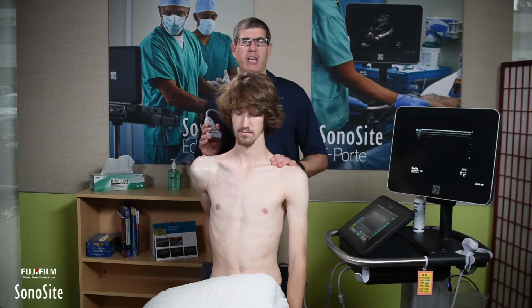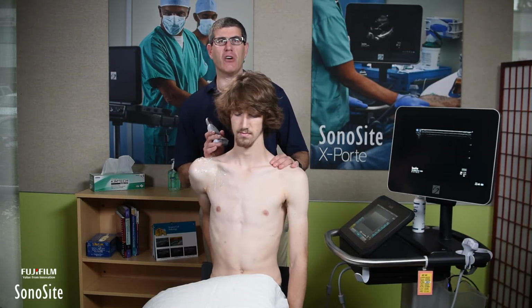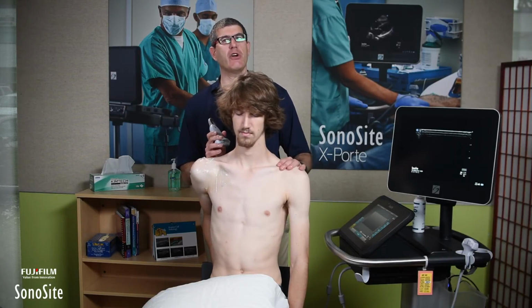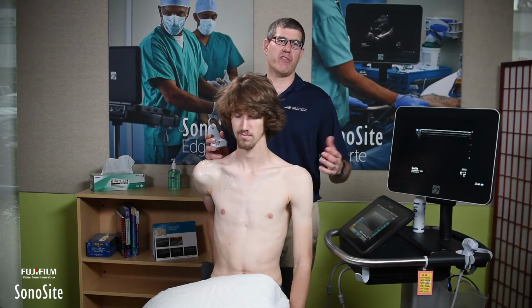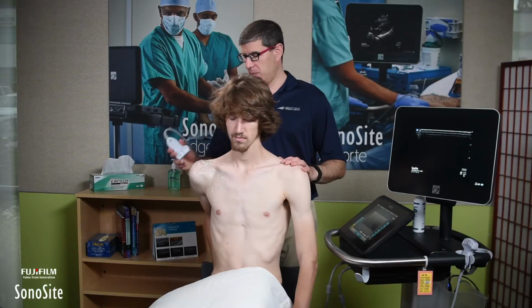Now, one of the things that's a little bit tricky, a lot of times patients who have shoulder pathology, this is like saying, hey, I know your shoulder hurts, so you mind if I put you into a chicken wing? So you have to recognize that not everybody's going to be able to handle this well.